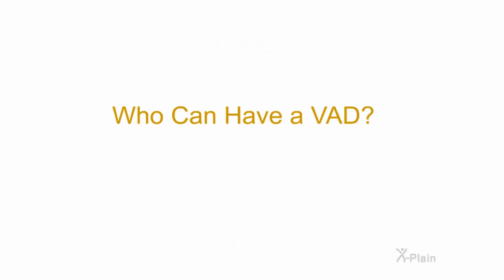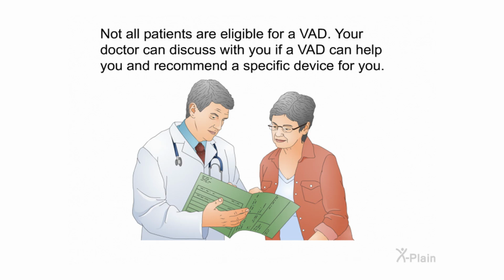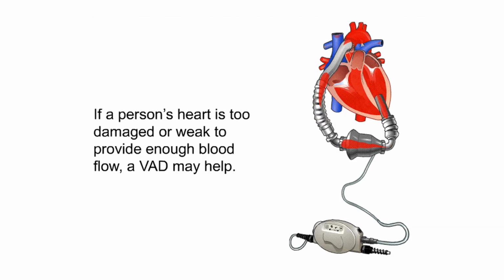Who can have a VAD? Not all patients are eligible for a VAD. Your doctor can discuss with you if a VAD can help you and recommend a specific device for you. If a person's heart is too damaged or weak to provide enough blood flow, a VAD may help.